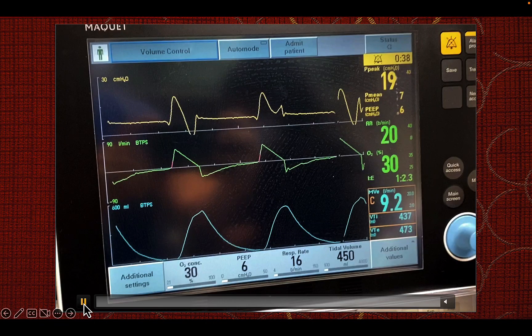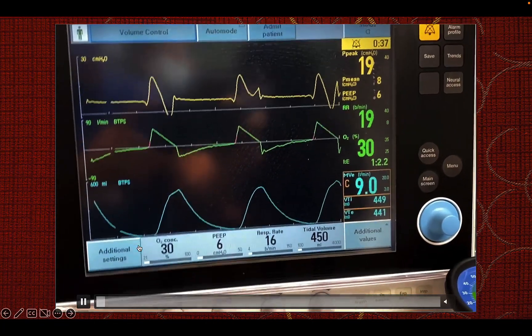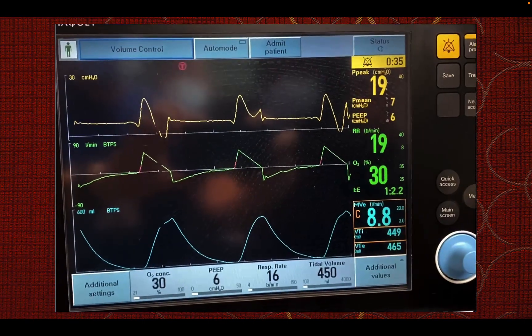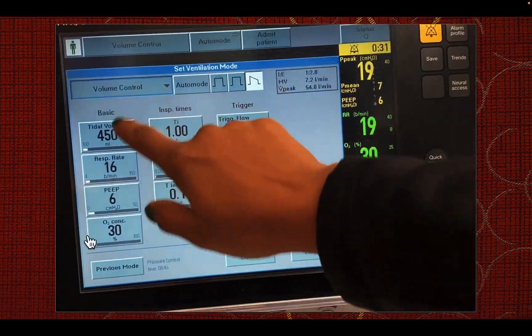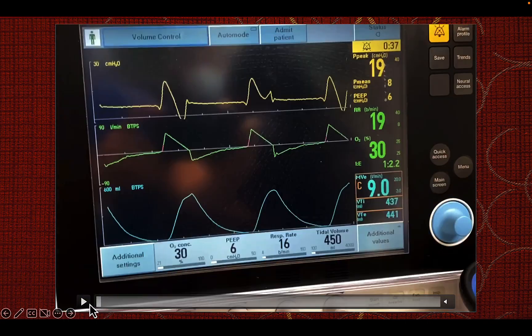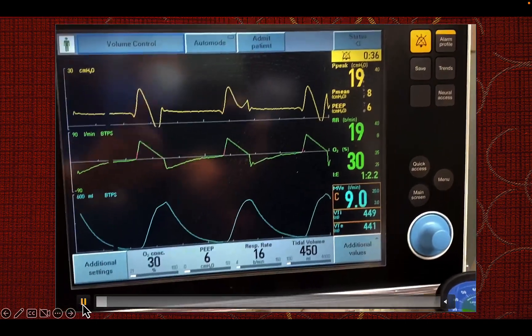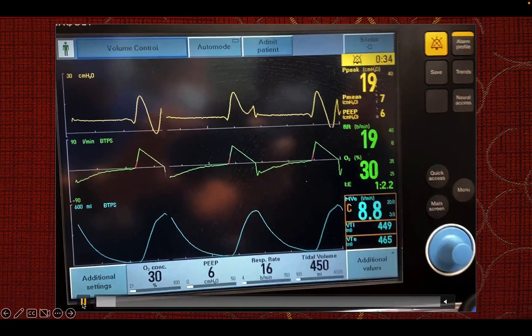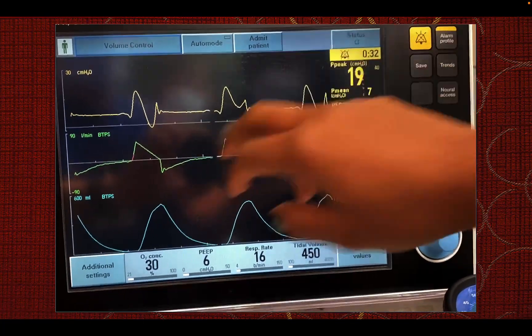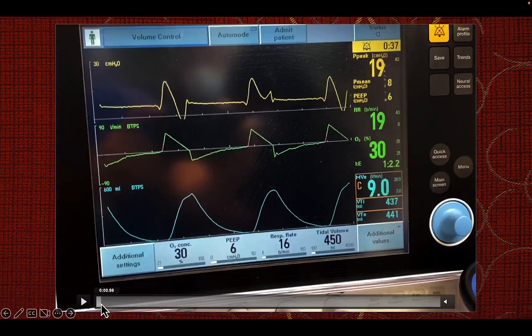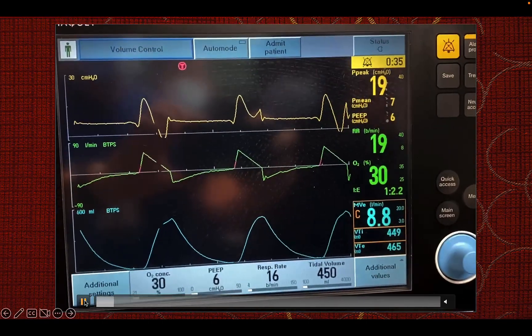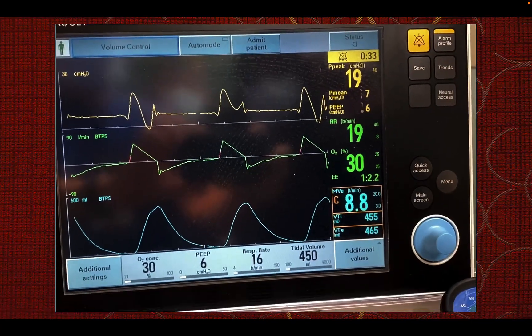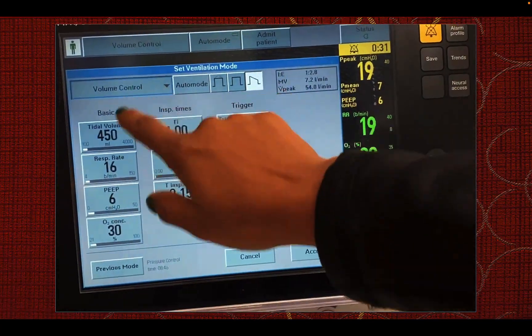So here is our case. We're going to walk through it. The camera's very shaky, sorry about that. This is volume control mode of ventilation, and we're just going to walk through the first dyssynchrony we see. If we take a look at volume control, something ain't right on that first waveform. Look at it one more time, zoomed in. So we're going to make some changes and try a different mode first.